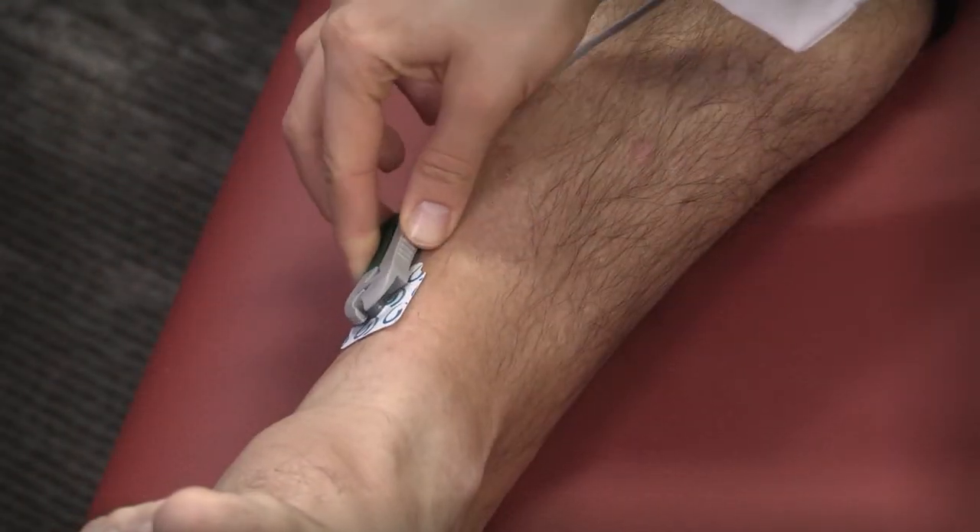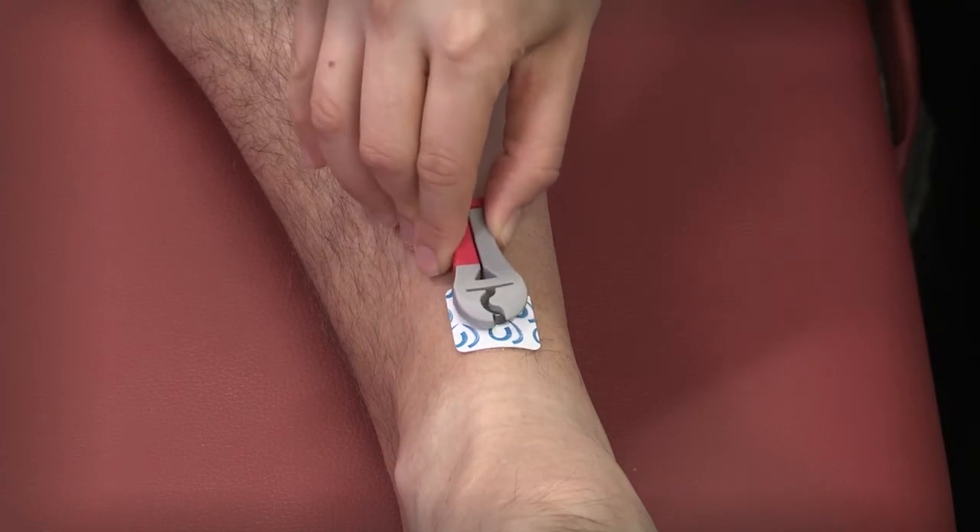Position the cables to ensure there is slack. Any tension on the cables may lead to noise artifacts on the ECG signal.